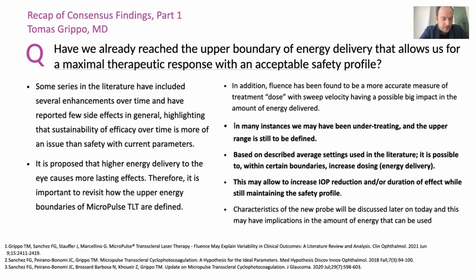Another concept that it's important to highlight is that although we understand at this point what the lower limits of energy are to obtain an effect, we acknowledge that we still don't know exactly the upper limits of energy that we can apply to the eye. At this point, we are exploring that, and most likely in the near future, we will be able to determine that with more certainty. We believe that this process has helped us define how we want to approach that in as safe a way as possible.